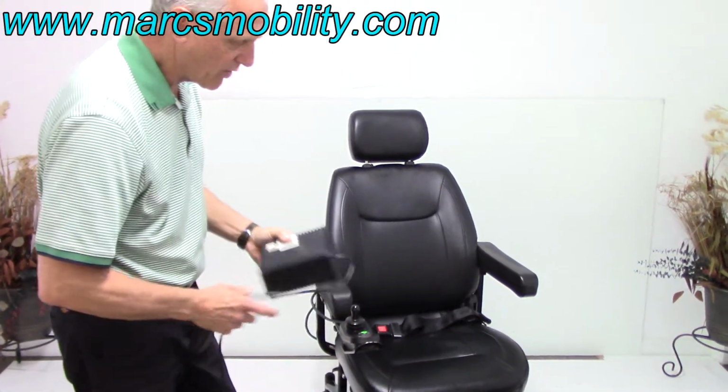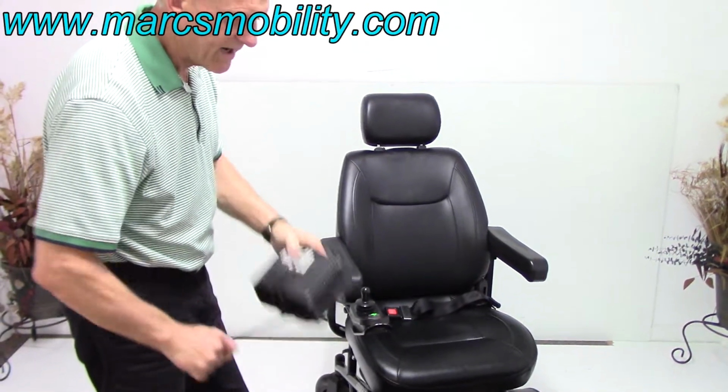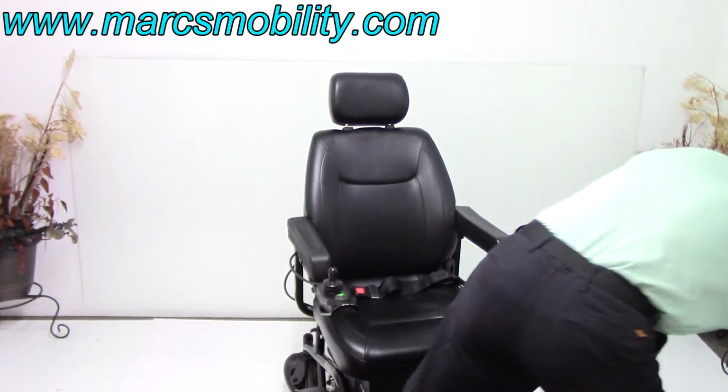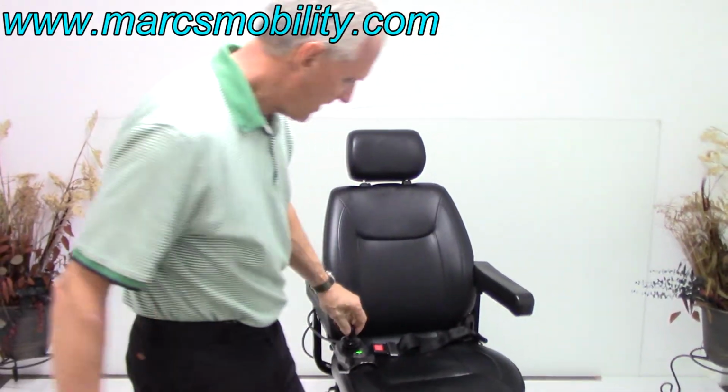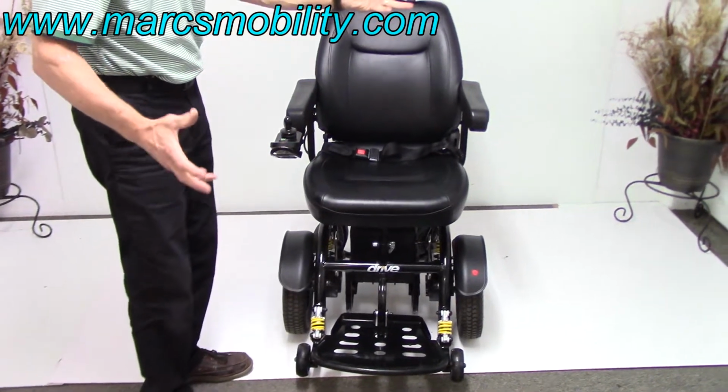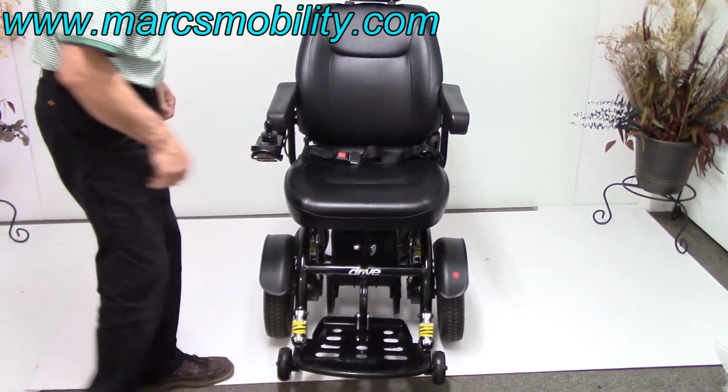It actually has a good horn. A lot of these chairs, you cannot hear the horn. So this one here, if you like horns, it does have a good horn. Now this chair, if you need to put this chair in neutral where you want to push it around for some reason, make sure the power is off.